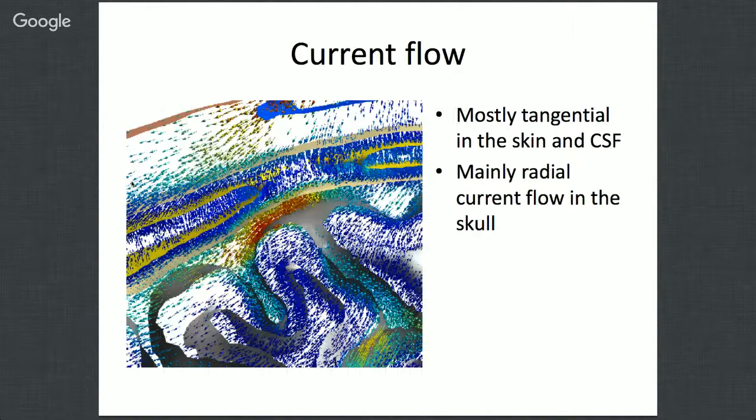That is a typical example of what you see for tDCS current flow. From one electrode, a lot of the current is shunted in the skin, which is higher conducting, so not everything enters the brain. There are regions with a thin skull where a lot of current enters the brain. A main determinant of where you stimulate with tDCS is the layer of CSF between the skull and the gray matter. In areas where you only have a thin CSF layer, you have high electric fields.